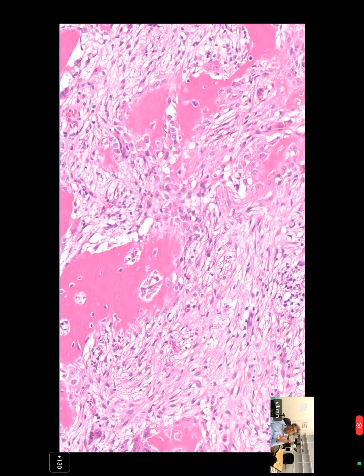Thank you, Karishma. So the differential diagnosis is osteofibrous dysplasia, characteristically in the tibia in kids in their teens or slightly younger. The differential diagnosis is a very well differentiated adamantinoma, where you just see a few clusters of epithelial cells. Adamantinoma is a locally aggressive tumor, while osteofibrous dysplasia is completely benign. There are two kinds of adamantinomas: the classic adamantinoma and the well-differentiated adamantinoma. The well-differentiated adamantinoma tends to overlap with osteofibrous dysplasia, and the distinction is that in adamantinoma you'll see epithelial cell clusters. Sometimes they're hard to see on an H&E. We typically use immunohistochemistry to identify these rare clusters.